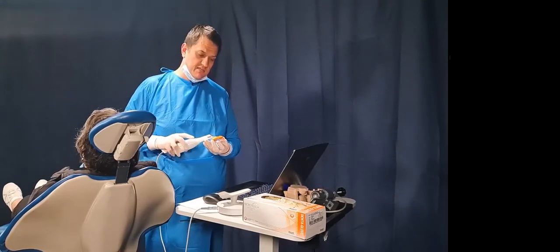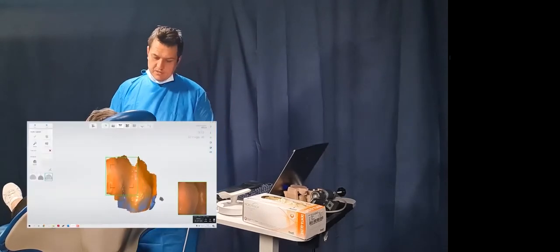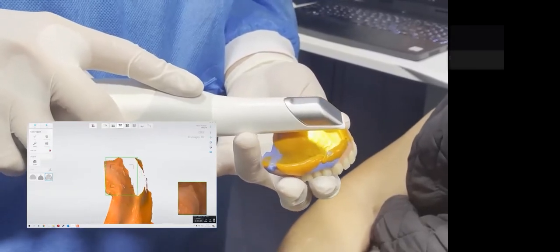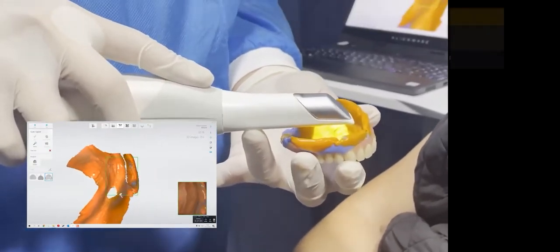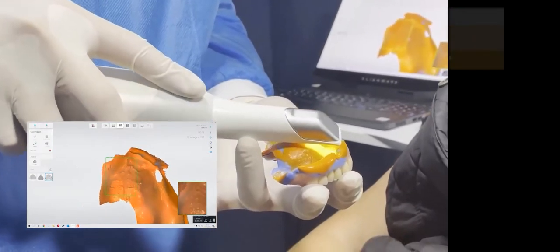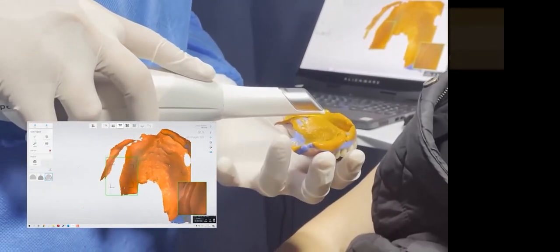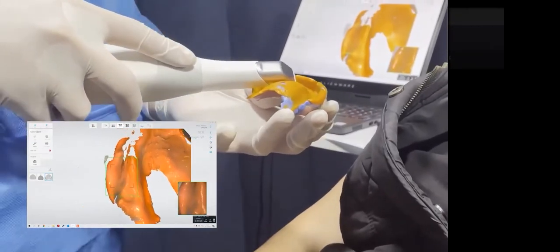So the first thing I start on the back here. Mr. Cameraman, you want to come in here? So I'll come and I'll scan over here so you can get a good view of it. So I'm just making my way down the depth, starting to fill in a few gaps as I go. Again, it's very easy to overstitch when you're doing this. So just getting our nuts and bolts again. Nuts and bolts, and I'm coming back around for a second pass.